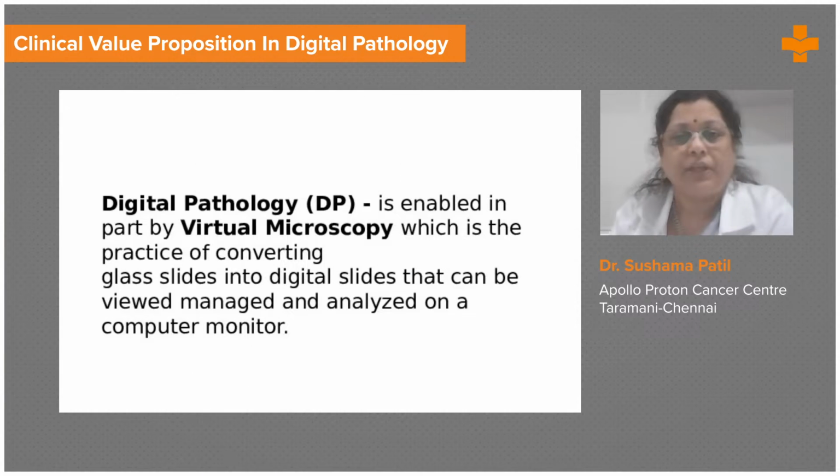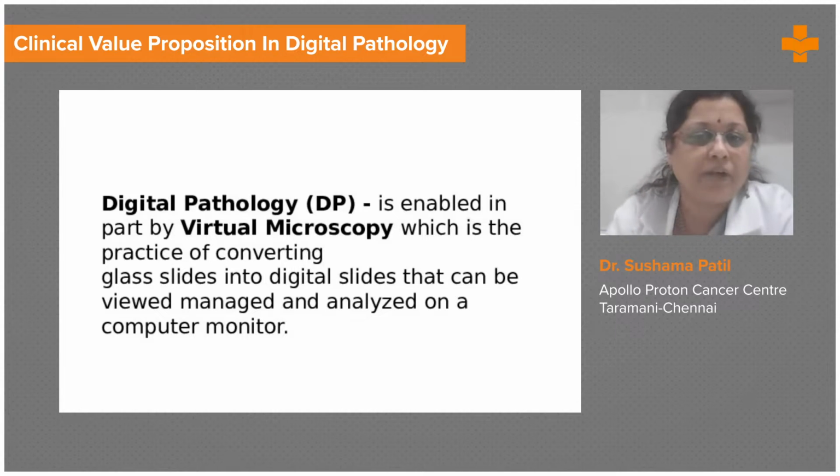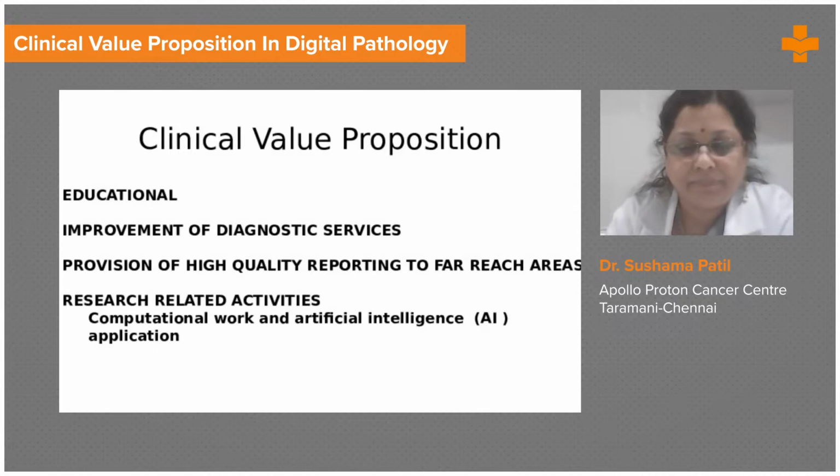So digital pathology is basically, as Varna has already explained, I'll just briefly tell you the introduction. It is enabled in part by virtual microscopy, which is the practice of converting glass slides into digital slides that can be viewed, managed, and analyzed on a computer screen. This is basically what digital pathology entails.